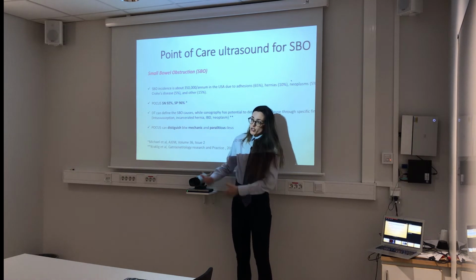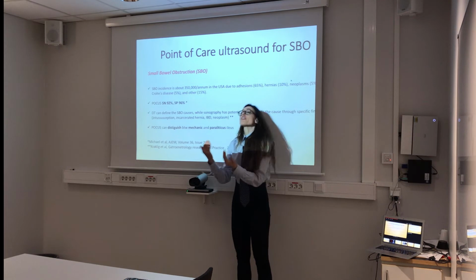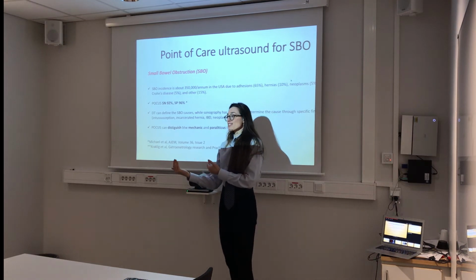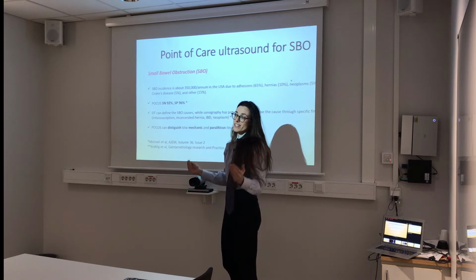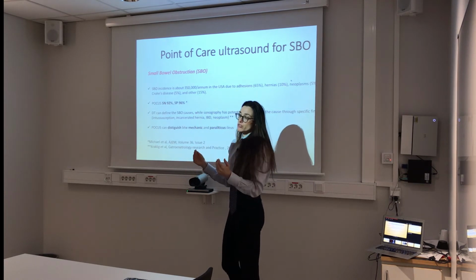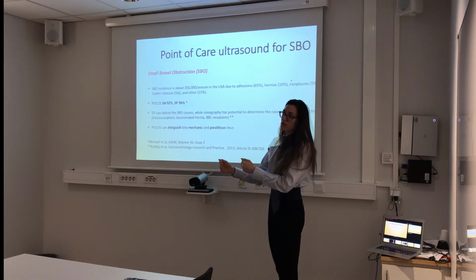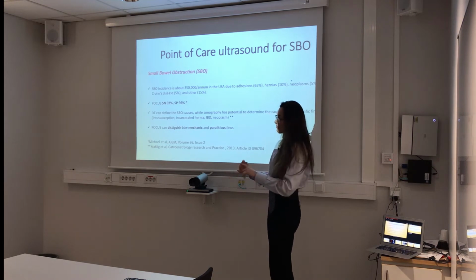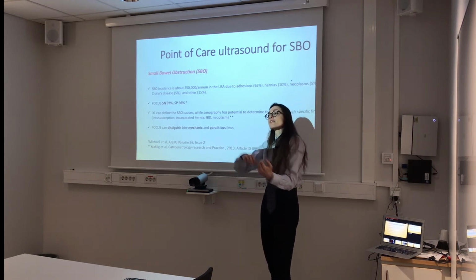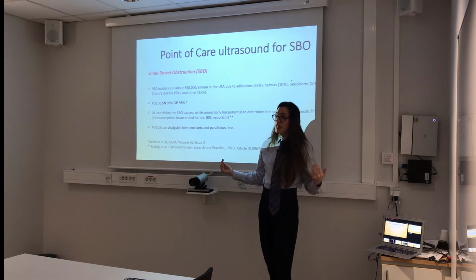Whether the ultrasound can show you also the volvulus, the hernia, or the intussusception. If not, we need to understand whether there is a cancer lying behind. So it's not possible in reality to just get an ultrasound. What I'm telling you is, by seeing the ultrasound, you know already that the patient doesn't have an appendicitis at this moment, or a gallstone, so that is not the priority, okay? Or an ischemia in the bowel, whatever.